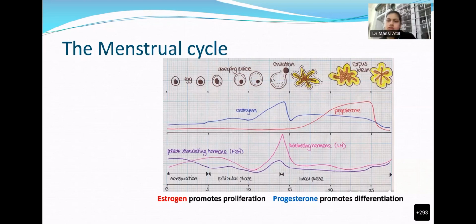We see granulosa cells, theca interna, theca externa. That's absolutely right. So it isn't just the granulosa cells. You also see a theca interna and a theca externa. Okay, and these are all sex cord stromal cells. The granulosa cells are most discernible.